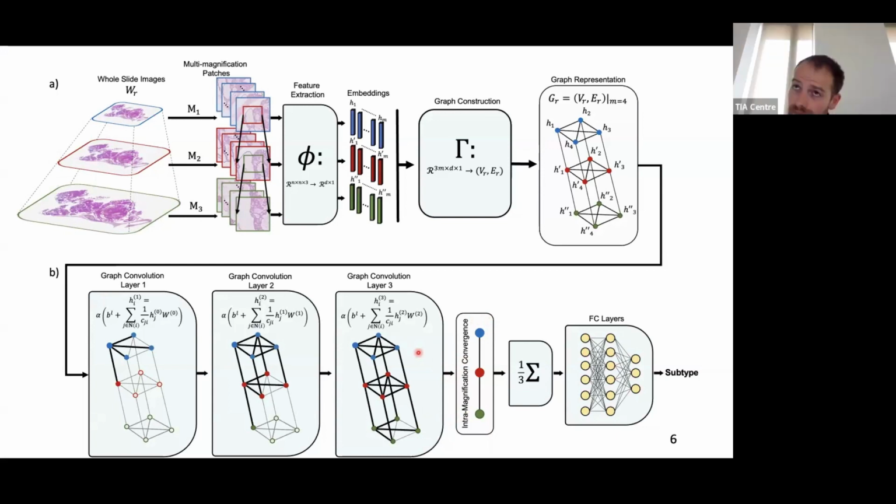In the case of pooling, maybe max pooling, you choose to do it at a certain point, and you have the unpooled results there if you need them. Whereas if it's baked into the architecture and happens outside of a specific pooling step, you don't have that information there anymore, even if you want to do something with it.